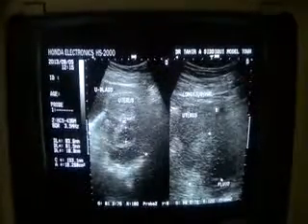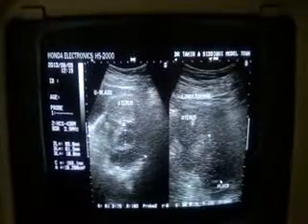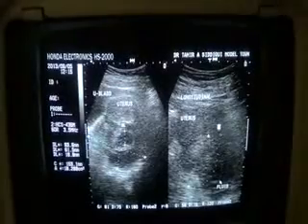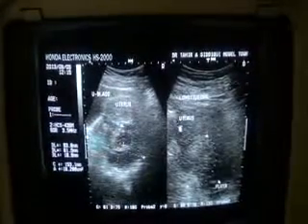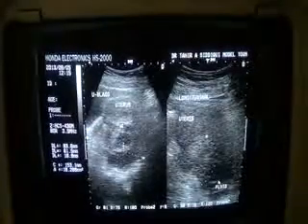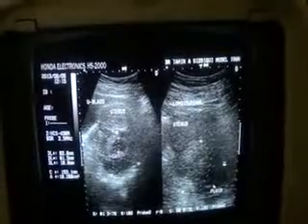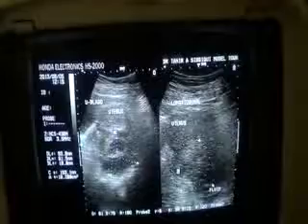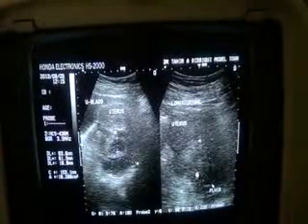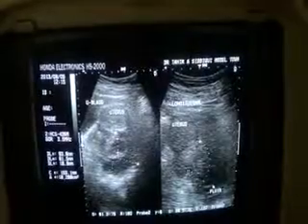This is the uterus in longitudinal section. The central echoes that you can identify are the endometrial canal. This is the fundal region, anterior myometrium, posterior myometrium, cervix. A small amount of fluid is seen posterior to this encircled inhomogeneous echogenic area.